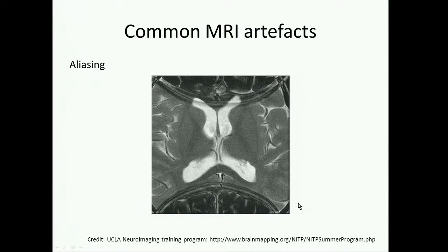I should say that I borrowed a lot of these slides from the UCLA and FSL imaging courses. So if you want to learn more, you can visit those pages.